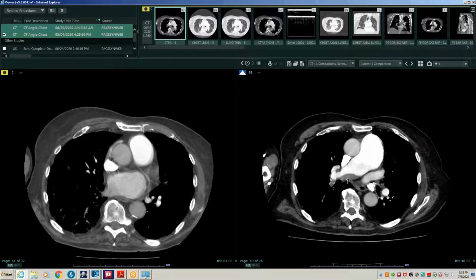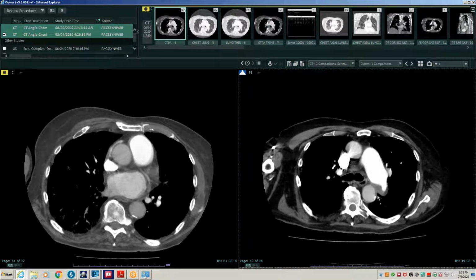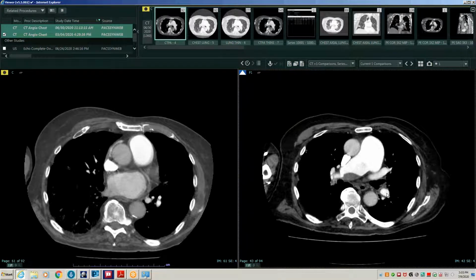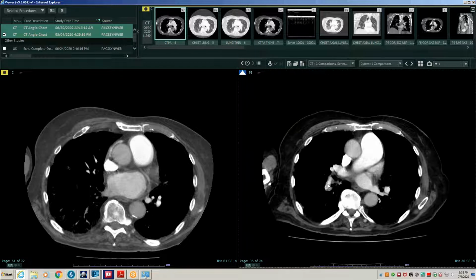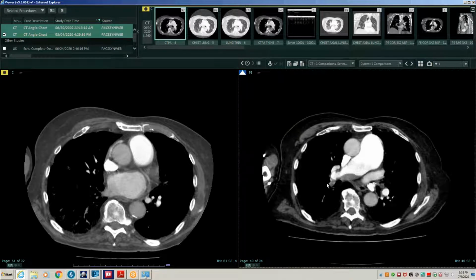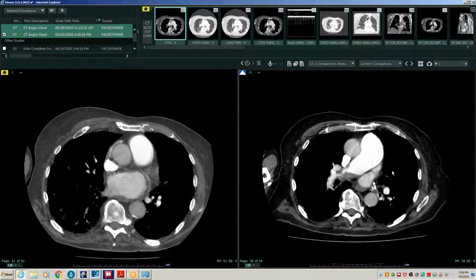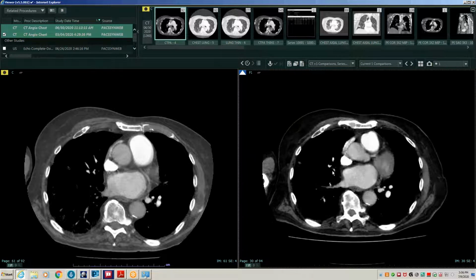So that's measuring kind of high, about 70. As we look at the rest of the pulmonary arteries, sometimes I see this and it's always like, is that in the pulmonary artery? Is it outside the pulmonary artery? Here it looks in the pulmonary artery, but then as you come down, maybe there's some pushing out a bit. And then certainly there are some little filling defects within the pulmonary artery here. So this, I guess, could be a chronic pulmonary embolism, and perhaps CTEPH would be one thing to think about.